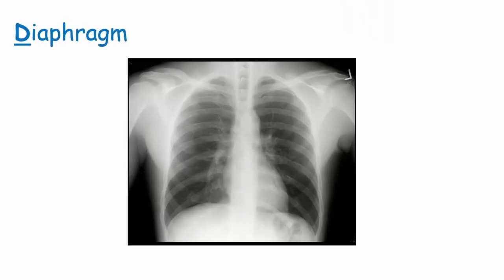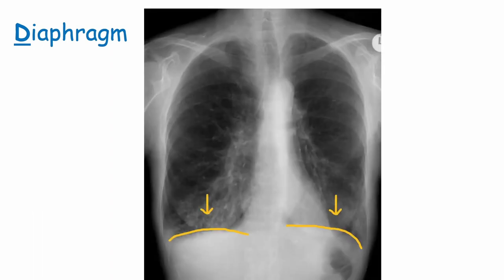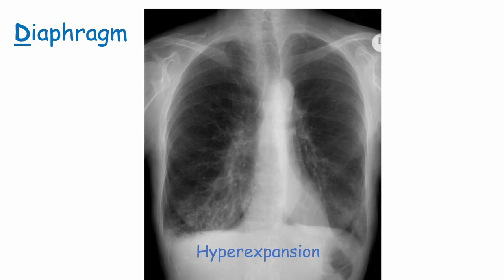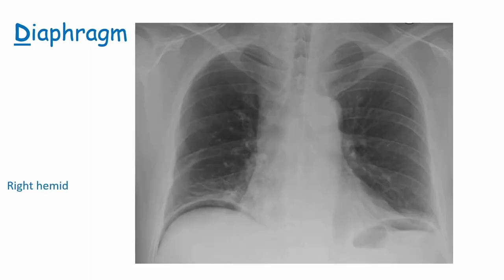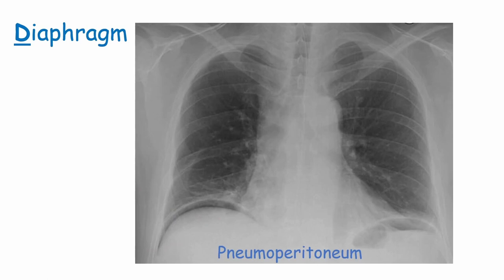D is for Diaphragm. On the chest X-ray, the diaphragms should be dome shaped, with the right sitting slightly higher than the left. Check that the diaphragms are not flattened. Air in the stomach is a normal finding under the left hemidiaphragm, but there shouldn't be air under the right hemidiaphragm. This patient's diaphragm has been flattened downwards — this is an example of hyperexpansion in a patient with COPD. Notice how the rib spaces are larger than normal. This next patient has air under their right hemidiaphragm, known as a pneumoperitoneum, which could be caused by intestinal perforation and therefore could also be a surgical emergency.